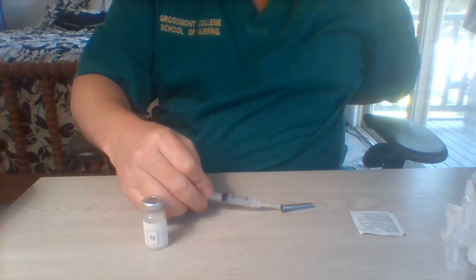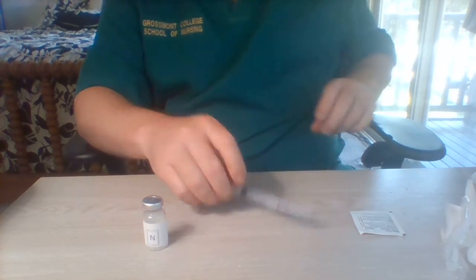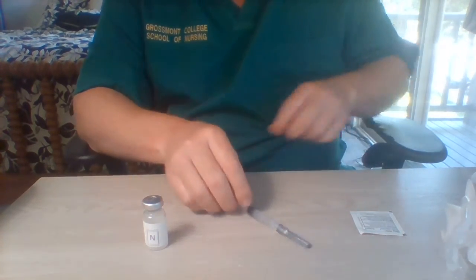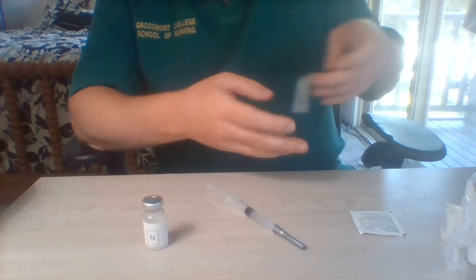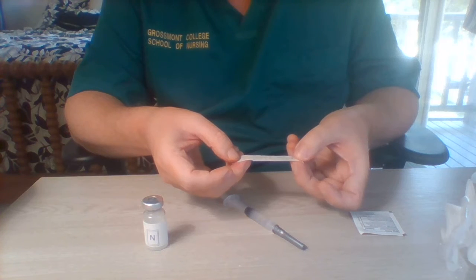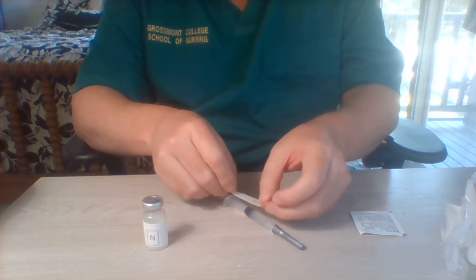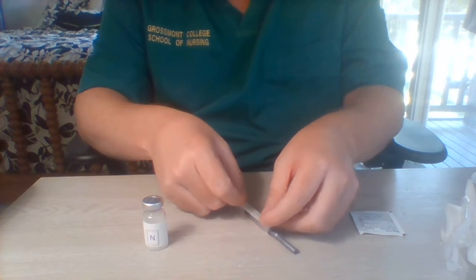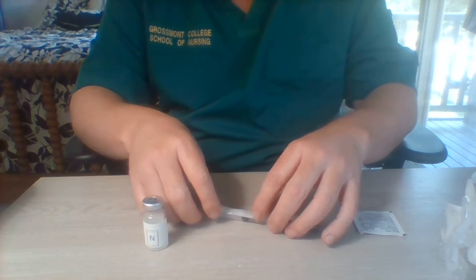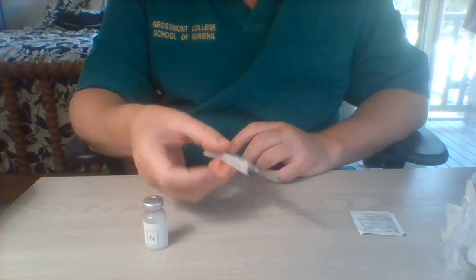I will recap this using the one-handed method. Secure it in. And now we need to label the syringe. I have a label here that I made with the name of the drug, Zofran, and the dosage amount, which is 2 milliliters. Put this on the side that does not have the numbers, and I'm ready to go to the patient's room.